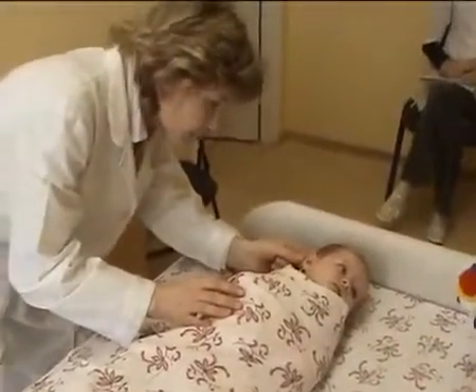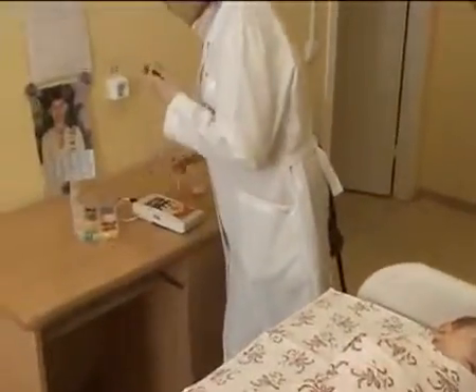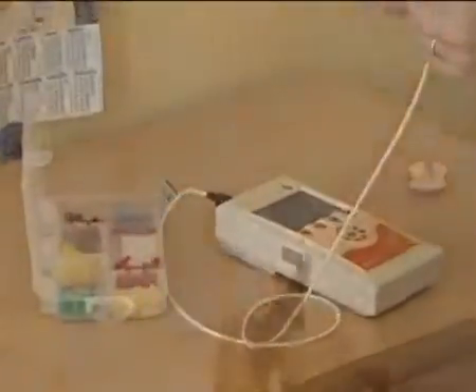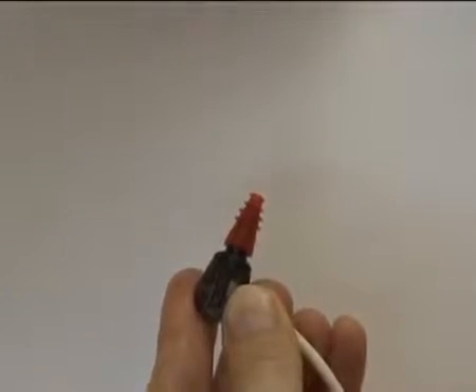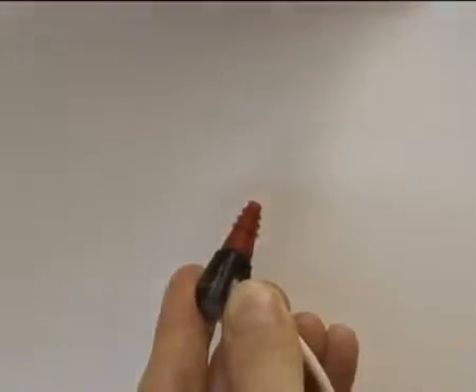It is preferable to start the test from the available ear. Select the ear tip matching a newborn ear canal by size. Place the ear tip as far down as possible on the probe tip. If there is any space between the ear tip and probe tip, the test results will be incorrect.